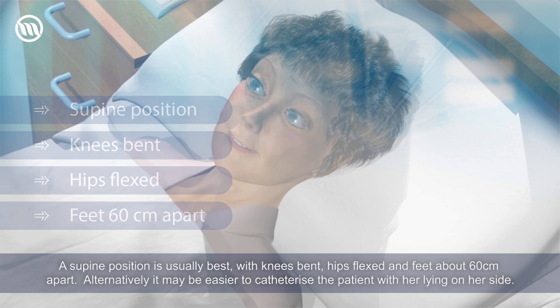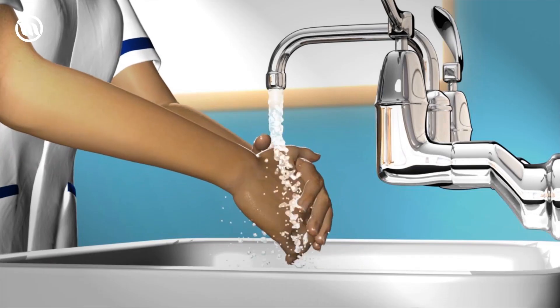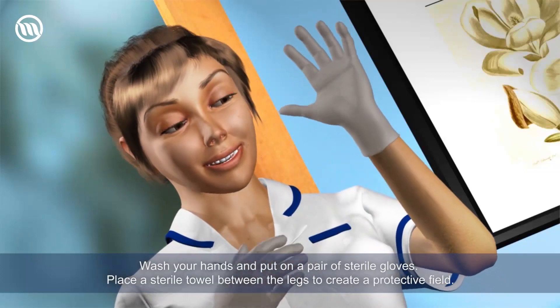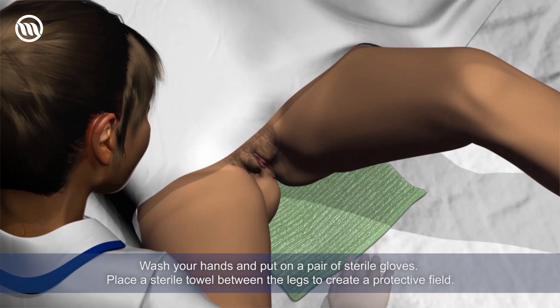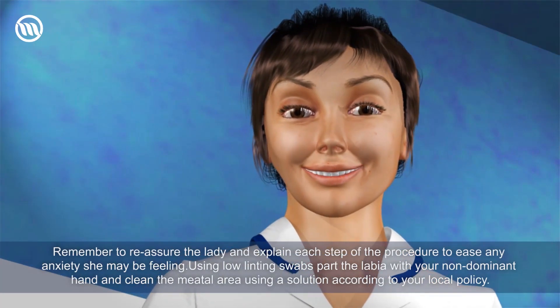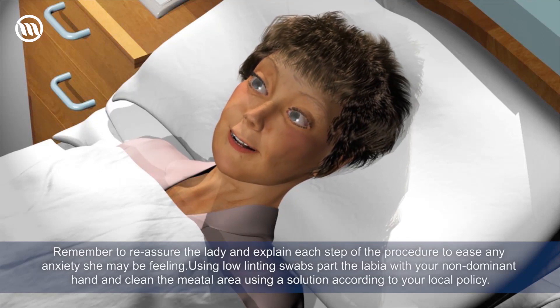Alternatively, it may be easier to catheterize the patient with her lying on her side. Wash your hands and put on a pair of sterile gloves. Place a sterile towel between the legs to create a protective field. Remember to reassure the patient and explain each step of the procedure to ease any anxiety she may be feeling.